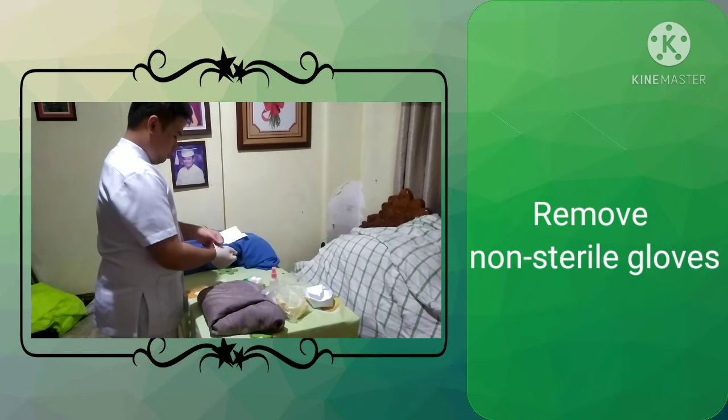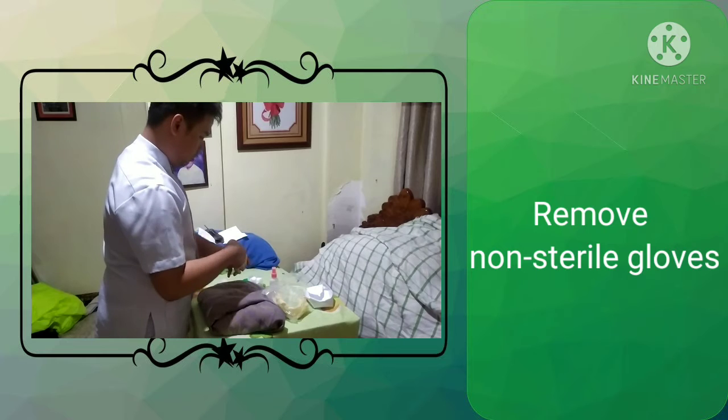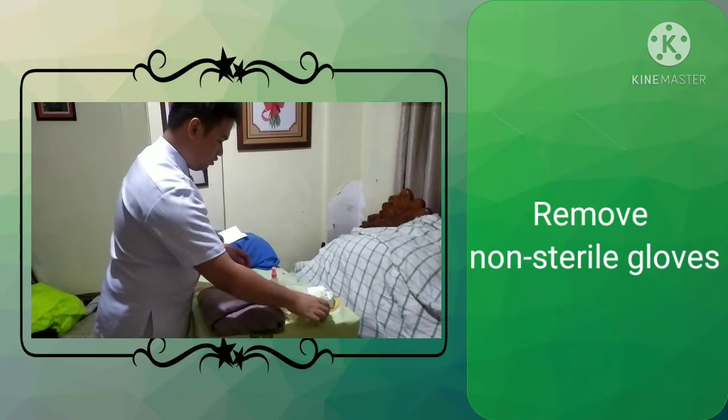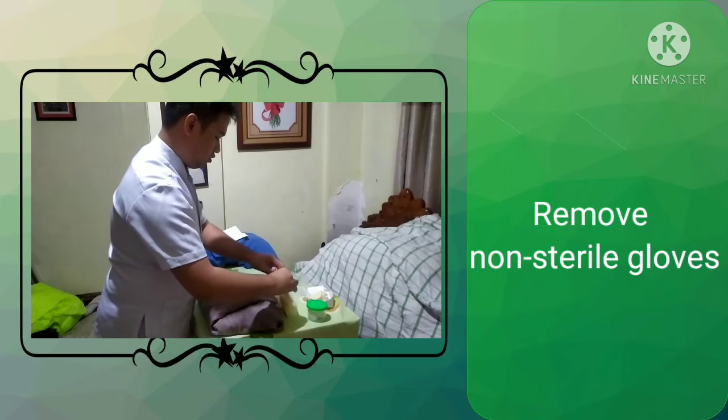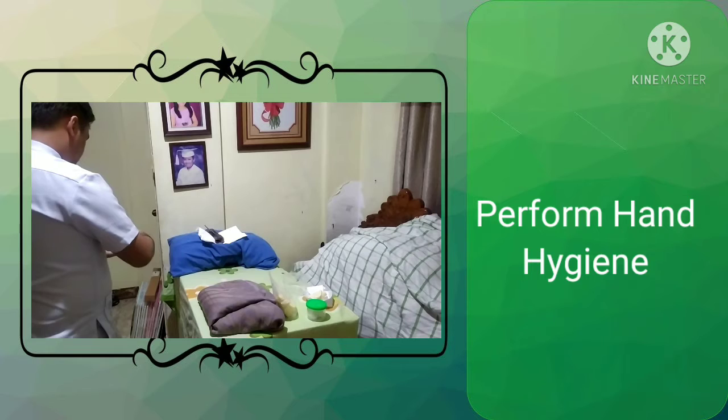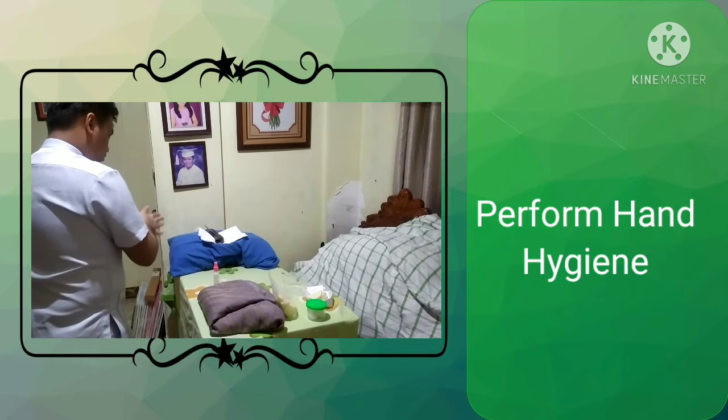Remove non-sterile gloves. Perform hand hygiene.